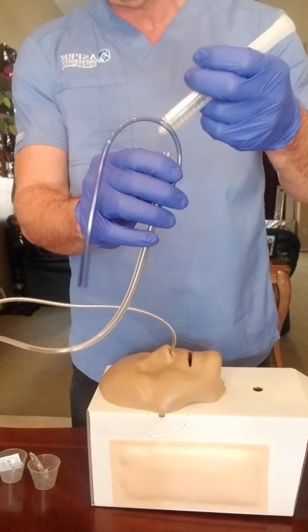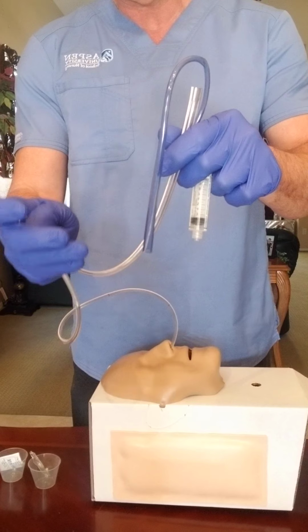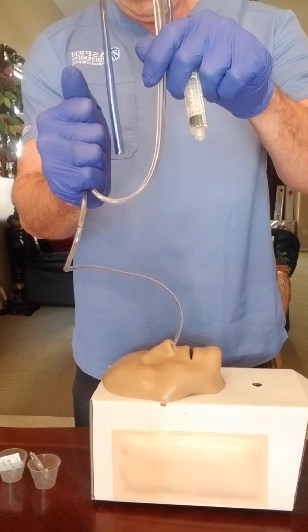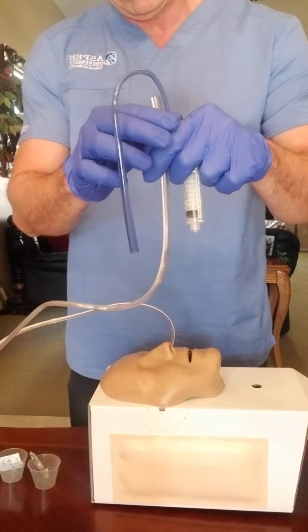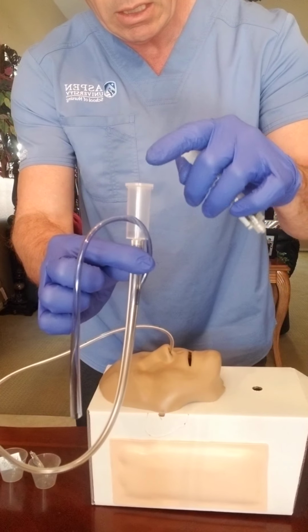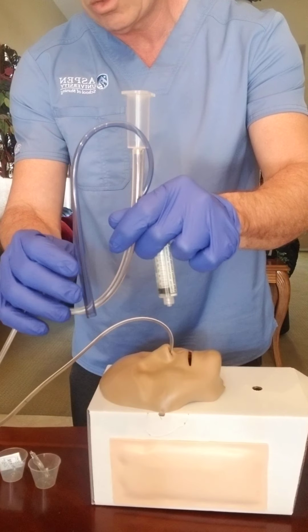Then I'm going to pour back in the NG tube about 10 ml of water, and I am going to kink it so that it goes down nice and slow, and I'm going to let that go down by gravity. I'm not going to force it, and I'm pretending that this here is my big syringe, and everything I'm pouring is right in there. Kink it, and that way I can control the flow.